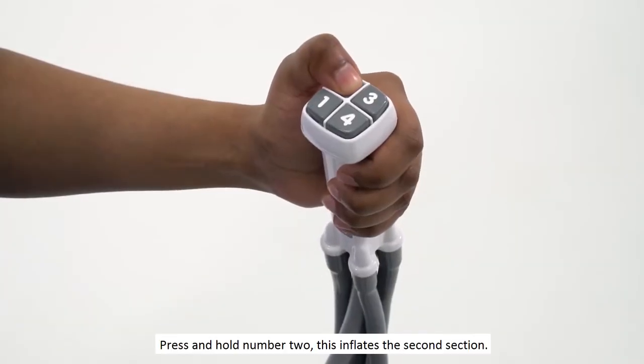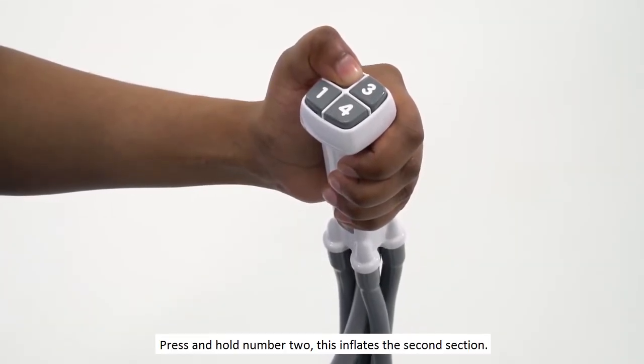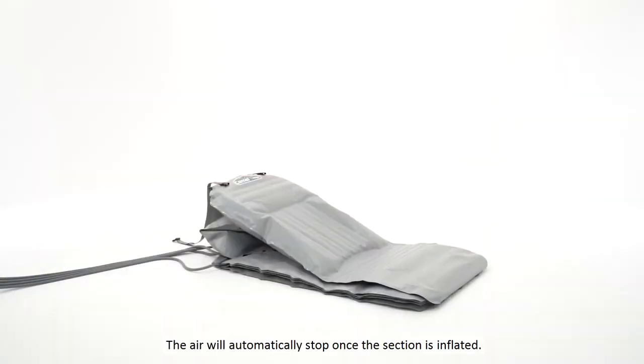Press and hold number two. This inflates the second section. The air will automatically stop once the section is inflated.